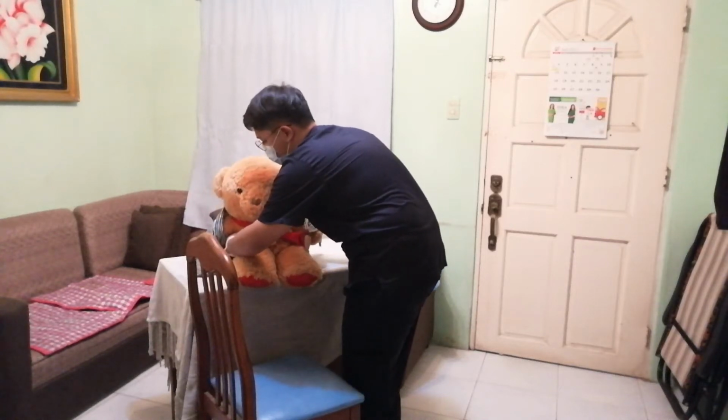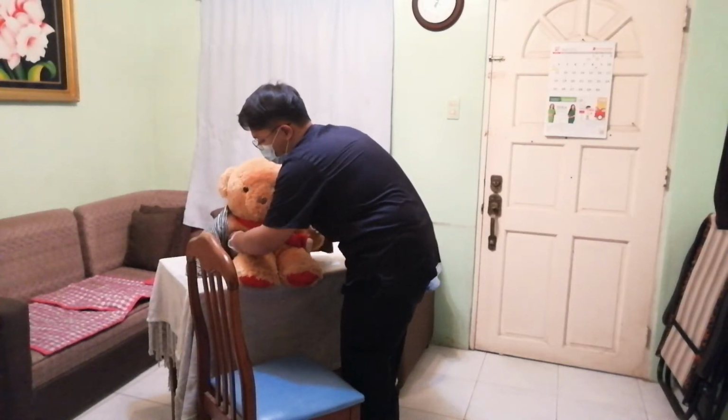Ma'am, ilalagay ko lang po yung gait belt. Thank you po.